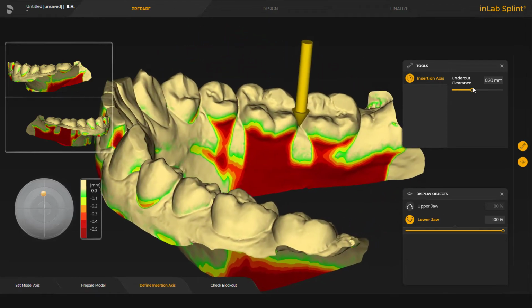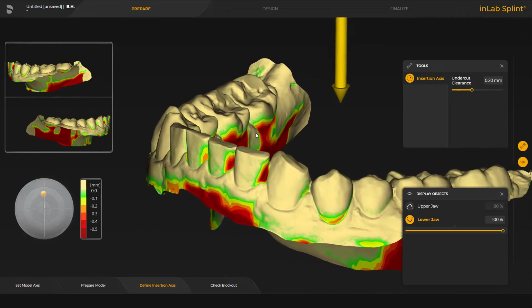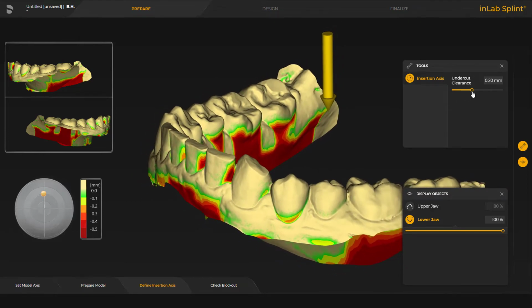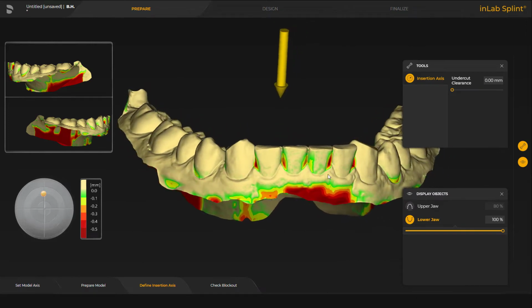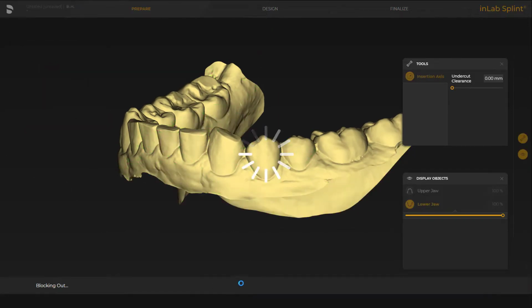And here by default we have the undercut clearance on 200 microns. That means the undercuts will be blocked out starting from 200 microns on. In my case, I'm going to set it on 0 because I will have an active fit, but I will design the undercuts on the manual part. To do that, we go and check out the blockout areas.